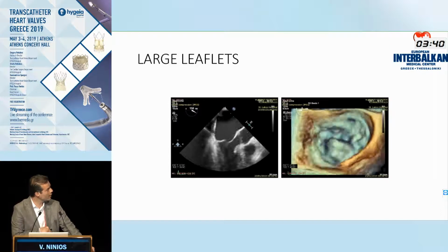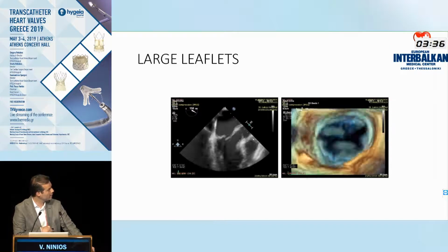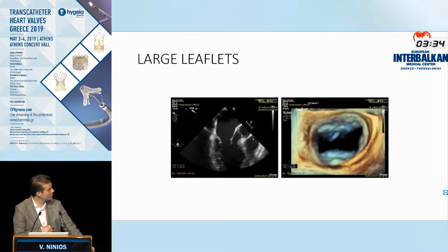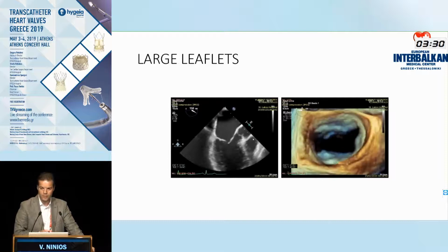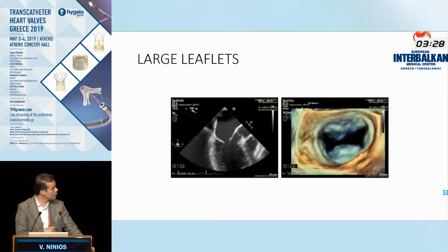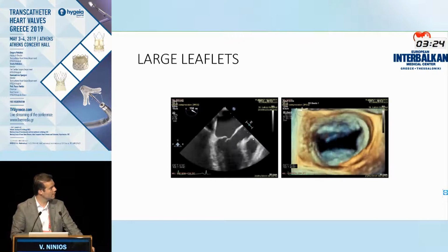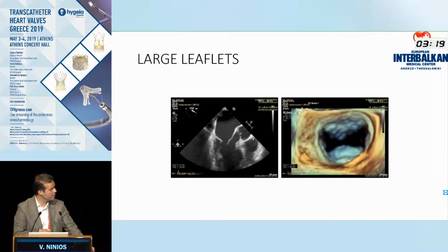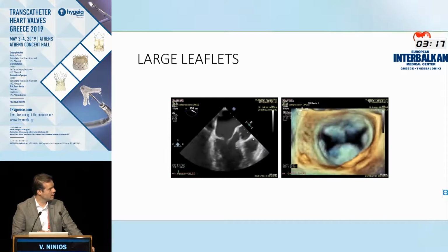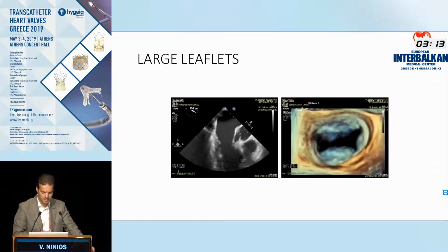This you can see on the long axis. The tip is flail, clearly, but you can see that the leaflet is unsupported by secondary cords all the way back to the annulus. So that's a problem. So by putting an XTR here, you can actually pull more tissue to the coaptation with the anterior leaflet. Also, we measured the length here, the prolapsing width, that was 2.3 centimeters.